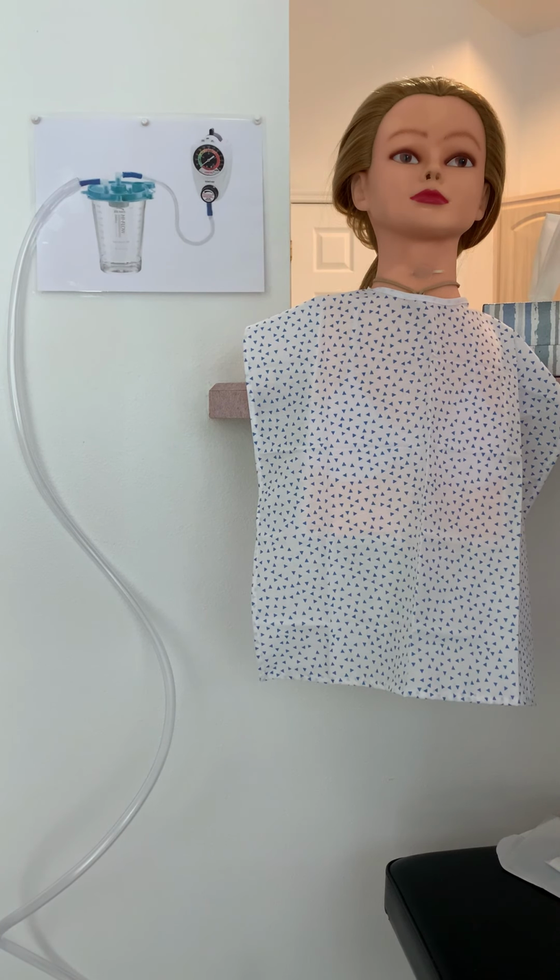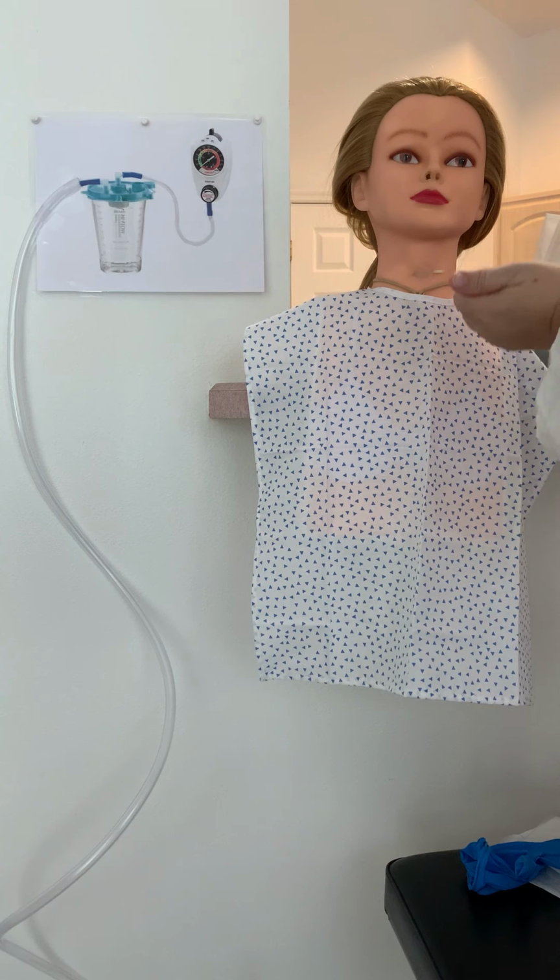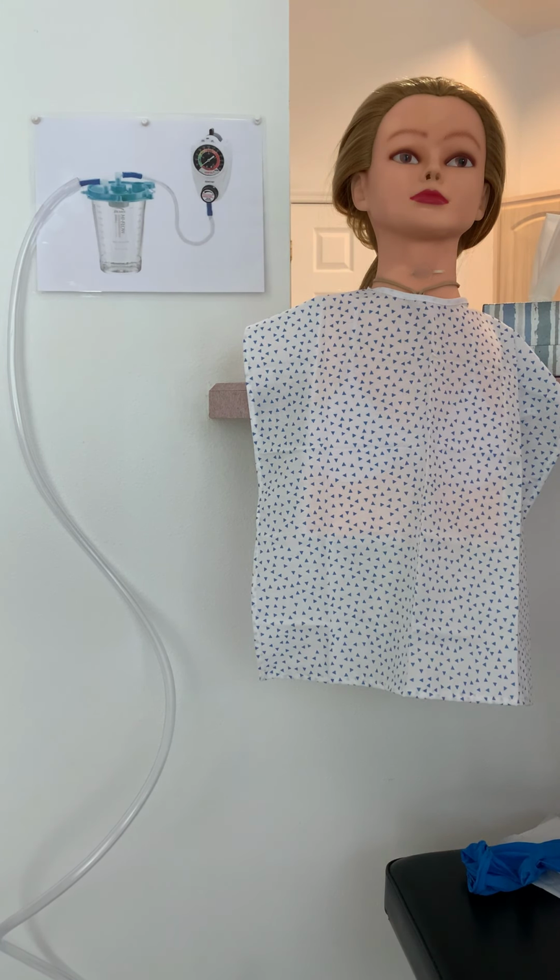So, thank you. I will check on you shortly. So, remove our gloves, wash our hands again, and then we're going to document, and we're just going to document that we removed the tube and how the client tolerated it.